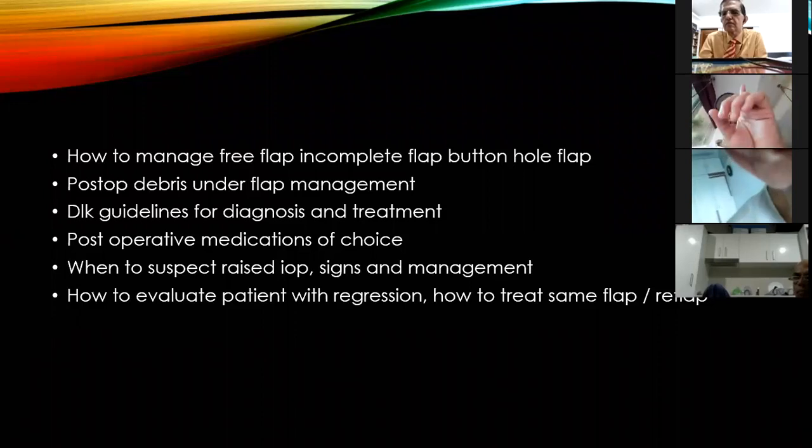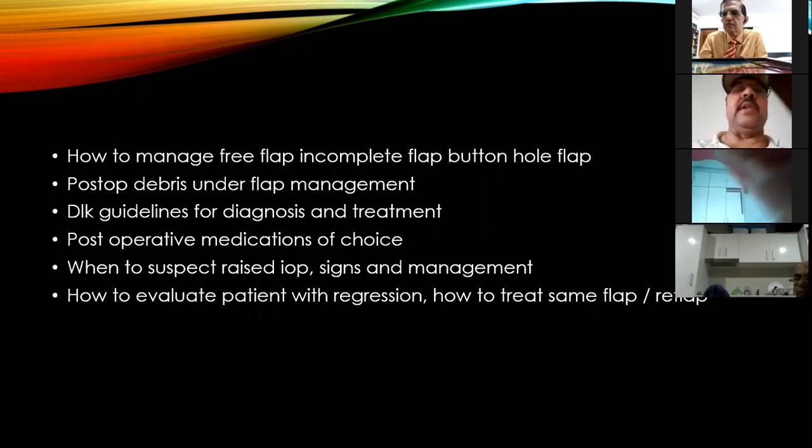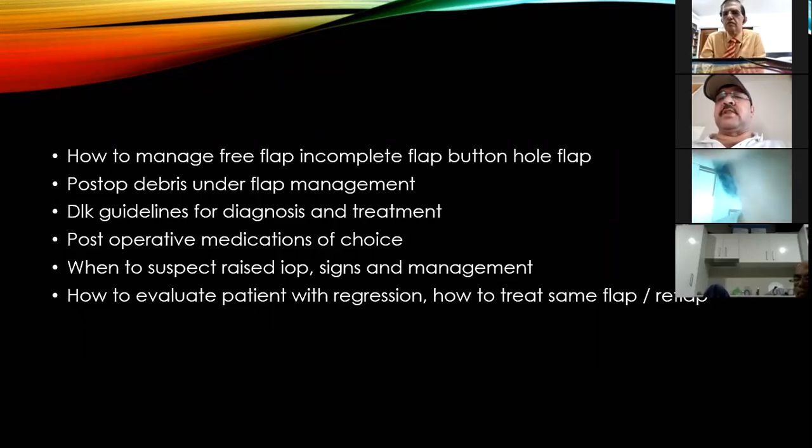Regarding the topolink, which Barjor said, I also do either topolink or OPD scan based, in which I started recently adjusting the spherical aberration at 4.5 millimeter and not 6 millimeter. Because you don't need this 6 millimeter of spherical aberration, and my number of unhappy patients has reduced drastically. So these are the few changes which I made in the last 6 months, and it has given me very good results. Thank you, Ramesh. Thank you for the comments.